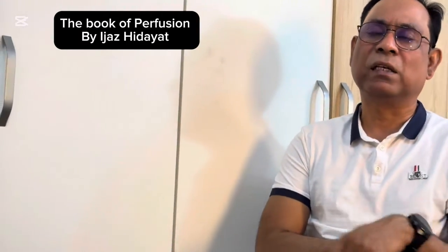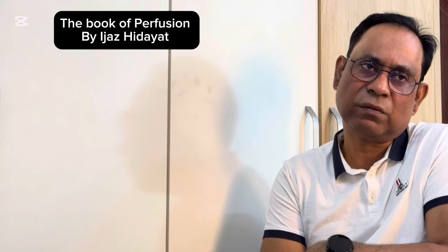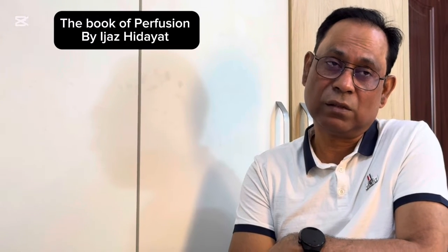Cardioplegia: in the past we used blood cardioplegia, but nowadays, as you know, custodiol cardioplegia or del Nido cardioplegia is available. If you are using del Nido or custodiol, you will get a long time to keep the heart stopped, like 120 minutes with the first dose, so the surgeon can easily work on the arch and can repair the arch or the buttons.